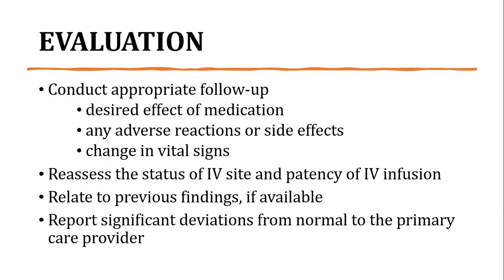Then, for the evaluation phase, conduct appropriate follow-up and include the desired effect of medication, any adverse reactions or side effects, change in vital signs. Then, reassess the status of the intravenous site and patency of intravenous infusion. Relate to previous findings if available. Report significant deviations from normal to the primary care provider.